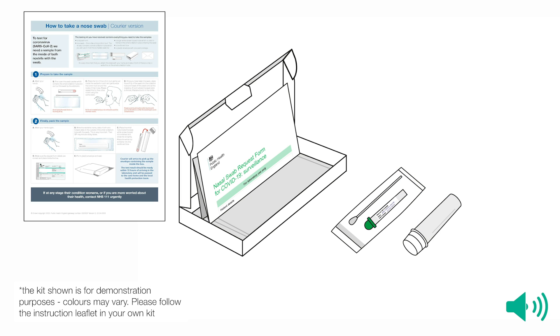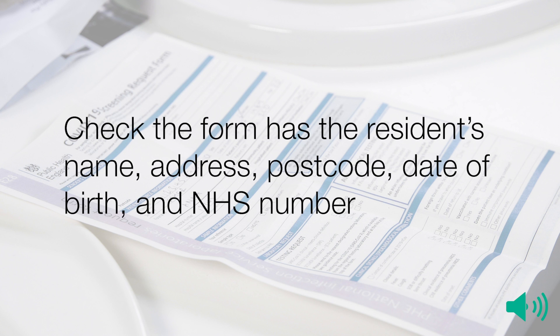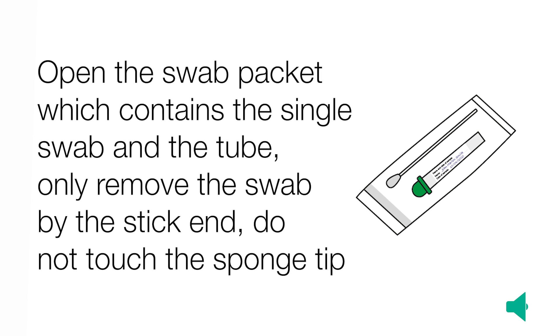The kit shown is for demonstration purposes; colours may vary. Please follow the instruction sheet in your own kit. Check the request form has the resident's name, address, postcode, date of birth, and NHS number. Open the swab packet, which contains the single swab and the tube.